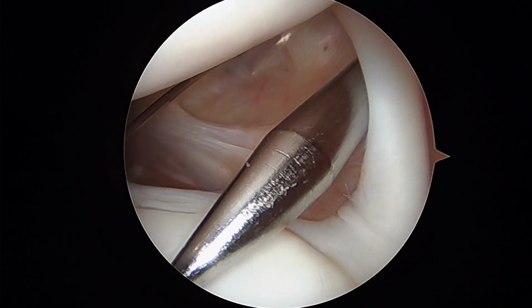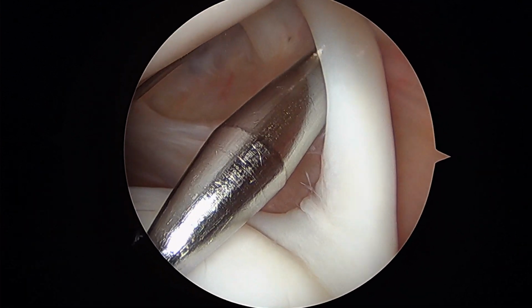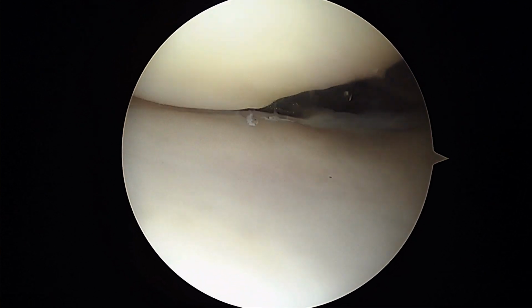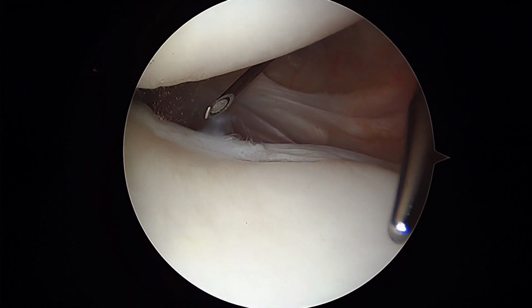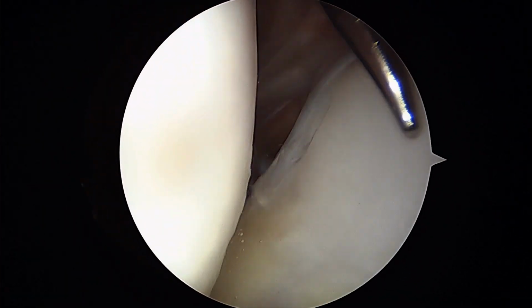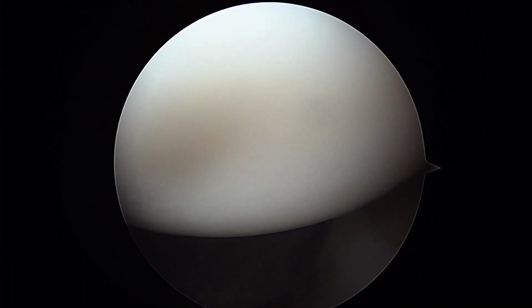The camera's coming in from the back and you're laying on your side, so the top of your shoulder is actually to the right on the screen. The bottom of your shoulder is to the left. If you were standing up and I was standing behind you, it would look like this. Okay, with the arm coming off, that's the humeral head coming off to the left.